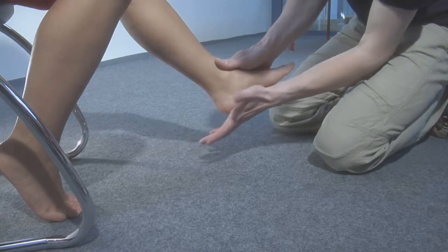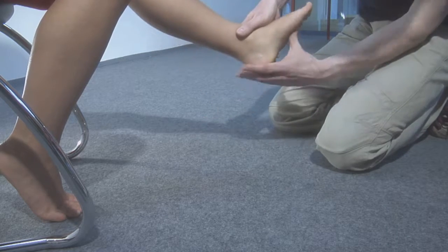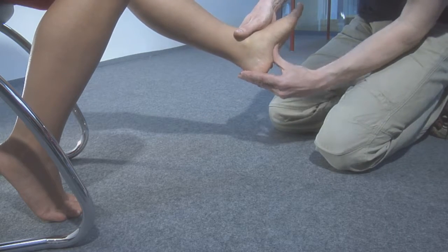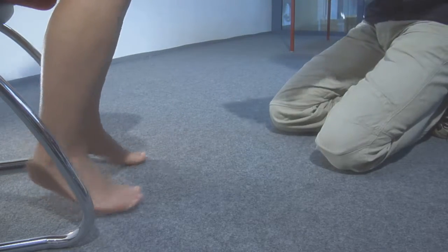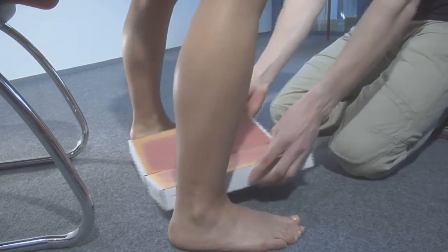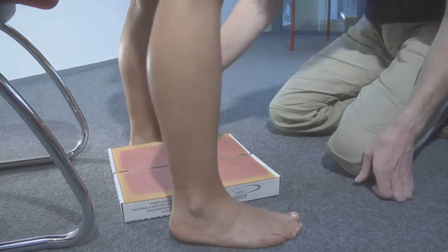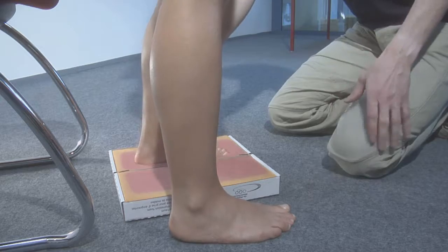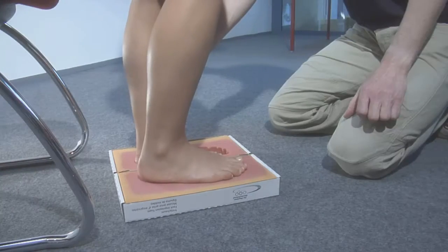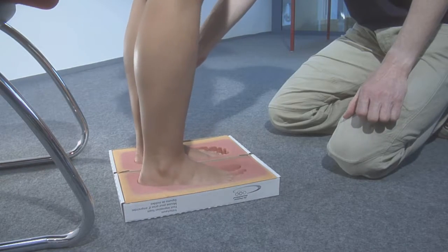All foot orthotic applications should start with a thorough foot assessment. This should include developing an understanding of the purpose and use of the insert, an evaluation of the shoe to be worn with the insert, and a foot imprint that displays weight-bearing pressure distribution across the foot. Foot imprints can be taken in various ways. Most common is an imprint foam or an electronic foot scanner.